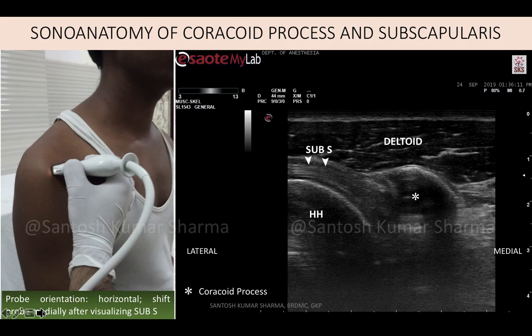One must also understand that the proximal part of the coracohumeral ligament becomes hypoechoic and thickened in case of adhesive capsulitis, and this is where the coracohumeral ligament originates from. The white hyperechoic line is the coracohumeral ligament.